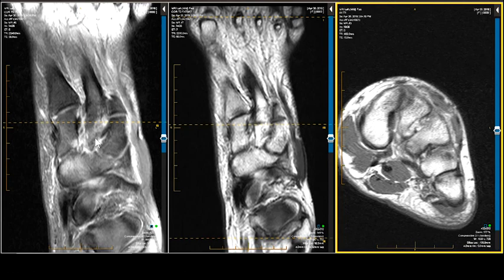And I just had that happen to a celebrity patient. I got called. Somebody read it as normal. I got a call from this celebrity orthopedic surgeon, who's a great guy, by the way. He said, it can't be. It can't be. This guy is an all-state football player, and he's going to Arizona State, and he'll probably play in the NFL. I got to be sure that it's intact. Somebody called it sprained or not injured. Well, it wasn't intact. It was transected. And so the next day he was in the OR, and he's actually in spring camp now getting ready for Arizona State. So this happens all the time.